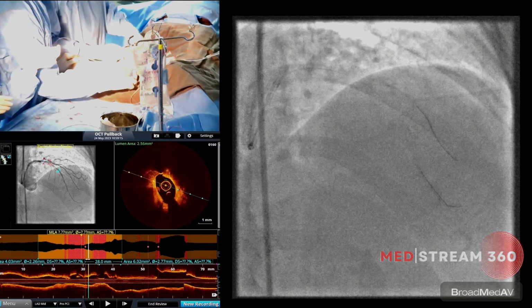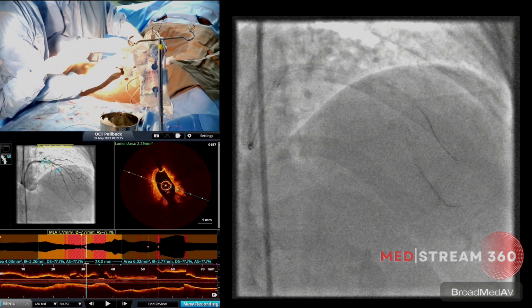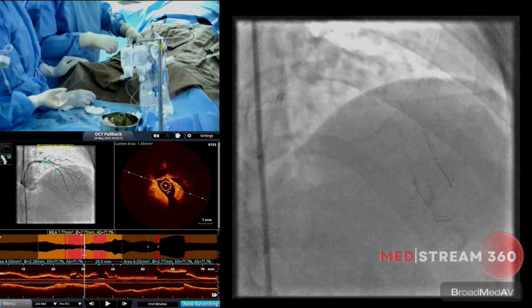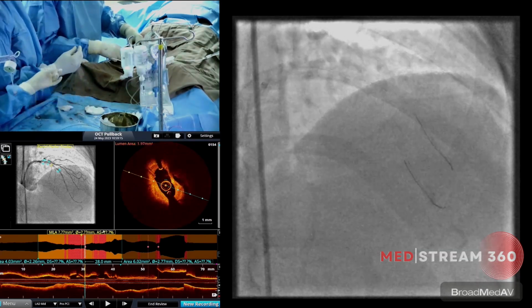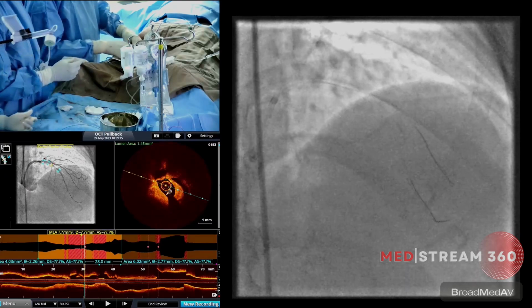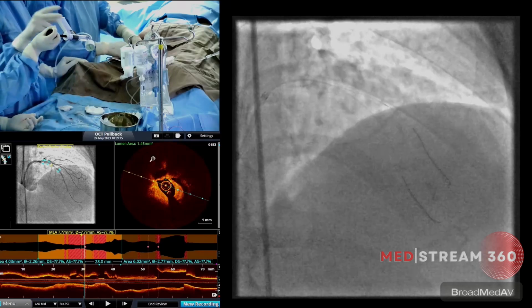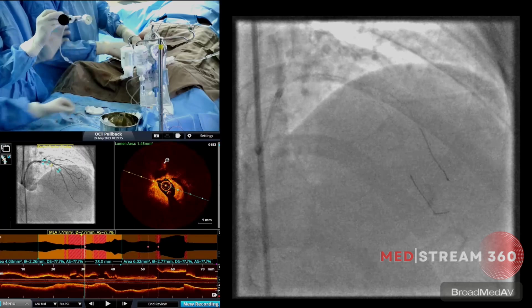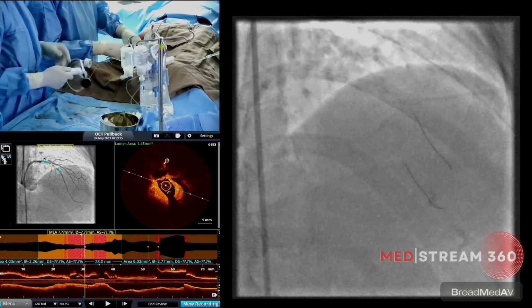So I am moving towards the diagonal ostium. We can see the wire. The 12 o'clock position is the diagonal wire. It's just entering into the diagonal. We can see clearly the diagonal ostium is diseased, but it's a focal disease, which means it is not extending beyond 5 millimeters of the ostium. Hence, maybe we can get away with only the dilatation and provisional single stent strategy.